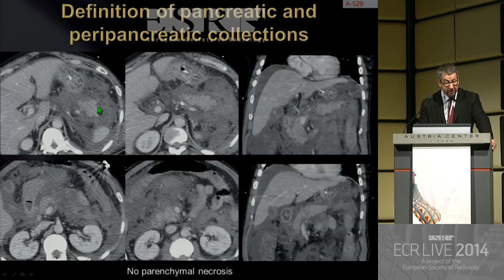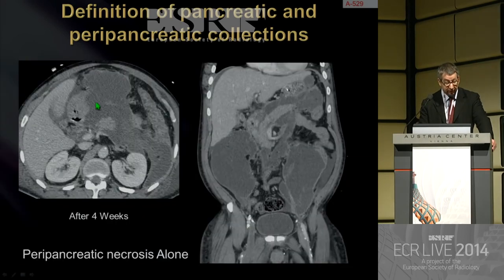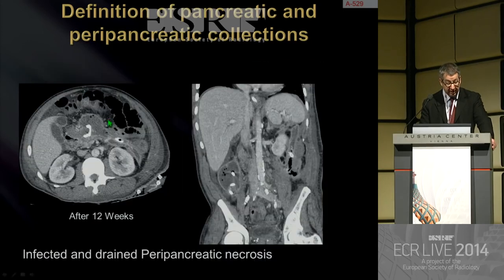Back to the case of only peripancreatic necrosis: the pancreatic parenchyma is clearly seen everywhere with no defect of enhancement and no intrapancreatic necrosis. But around the pancreas, it is clearly not APFC — it is acute necrotic collection. After four weeks it becomes walled-off necrosis — peripancreatic necrosis alone. After 12 weeks, the patient recovers after five months of hospitalization with successful drainage.